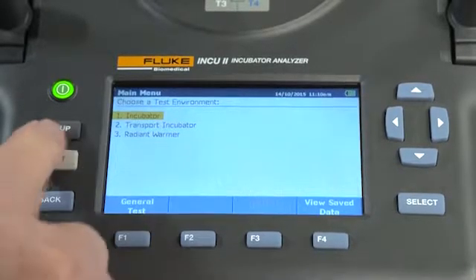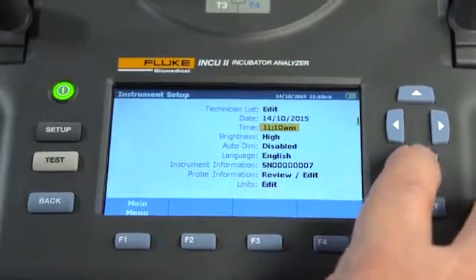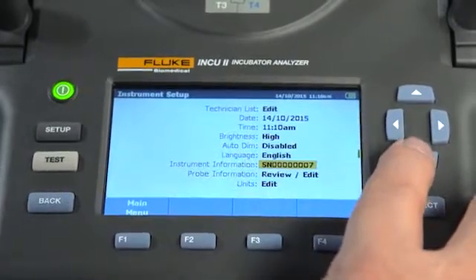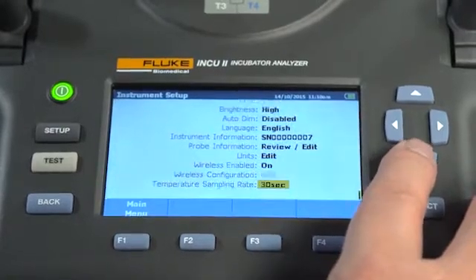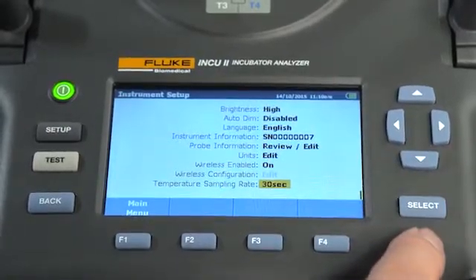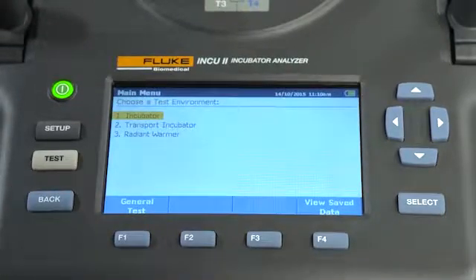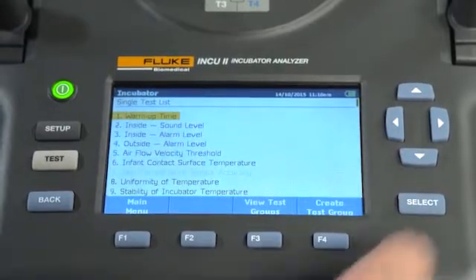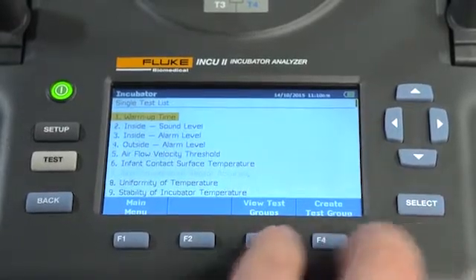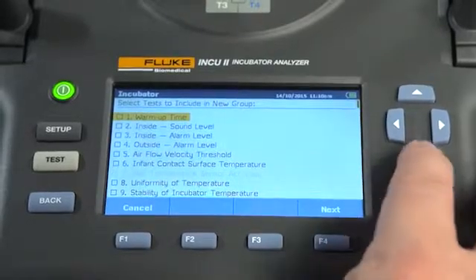The Setup button allows you to change your measurement units, view the details of the device, and select your sampling rate. The Back button allows you to go back to the previous screen. Along with using the standard tests, you can create your own testing groups or unique testing procedures, which can further increase efficiency and tailor testing to your facility's protocols.